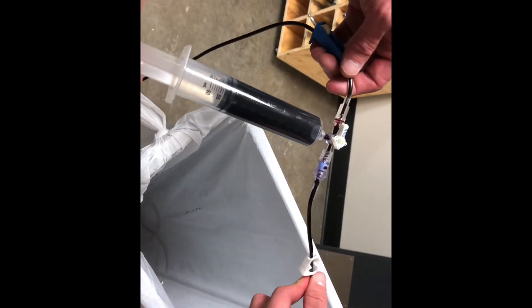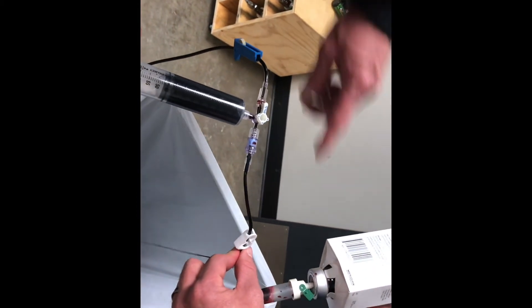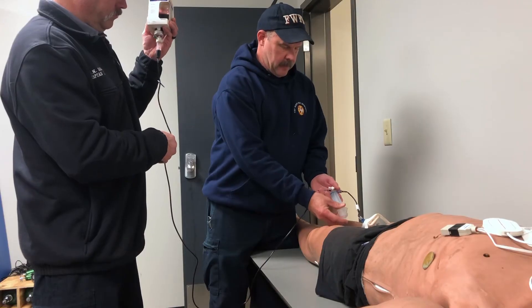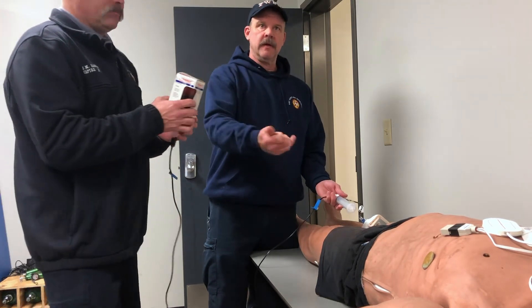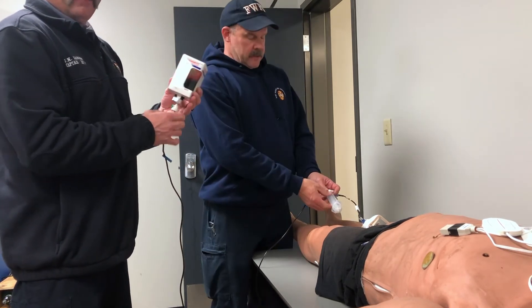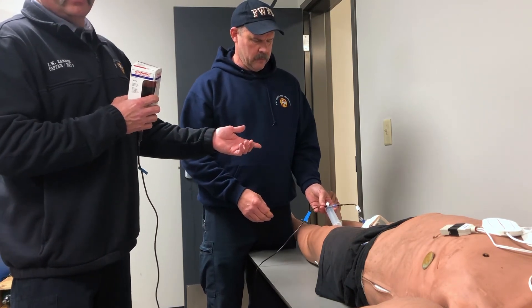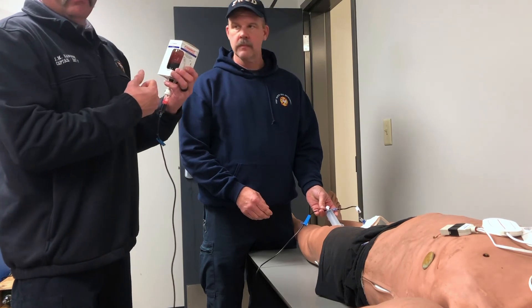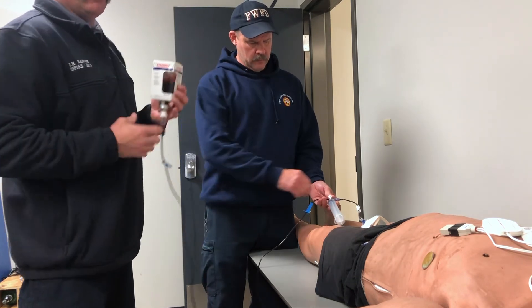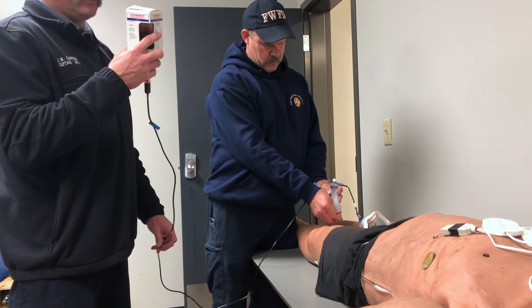If you can't get it to come into the syringe from the bag, make sure your little vent valve is open — a lot of people forget about this because we're not used to it with normal IVs. Once that's complete, cycle back, turn it off towards the patient, draw it up, and then push it again. Just take your time with it and eventually you'll get all the dosage you need.